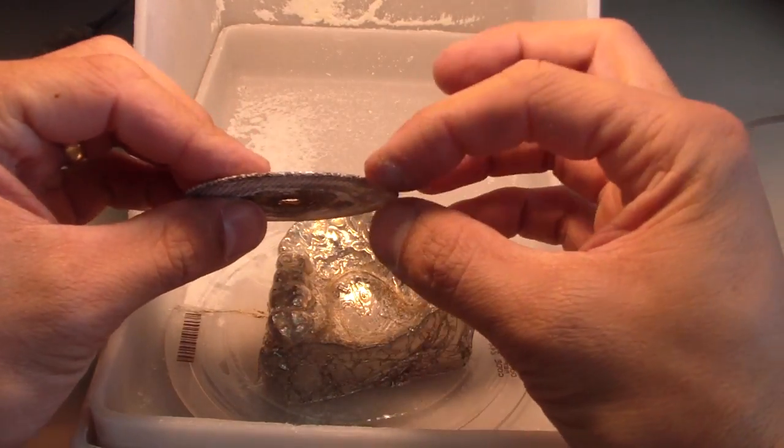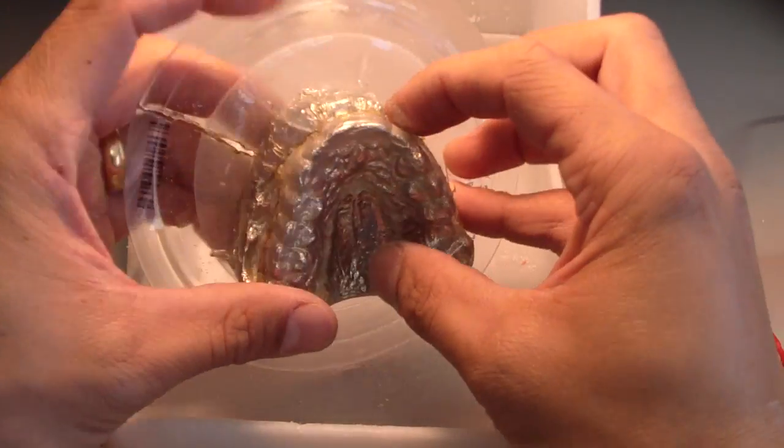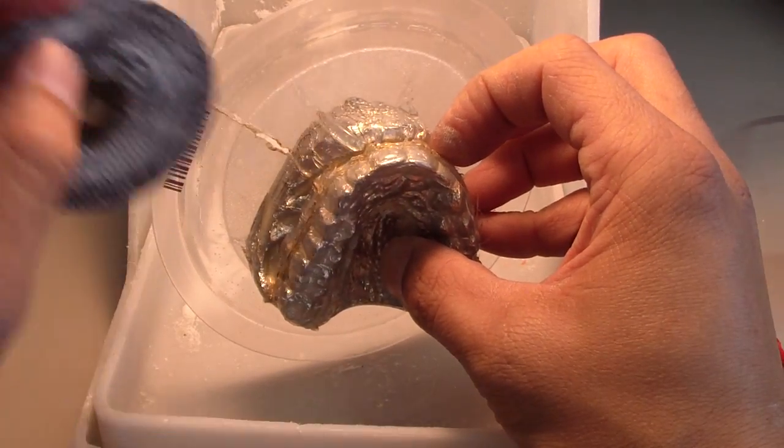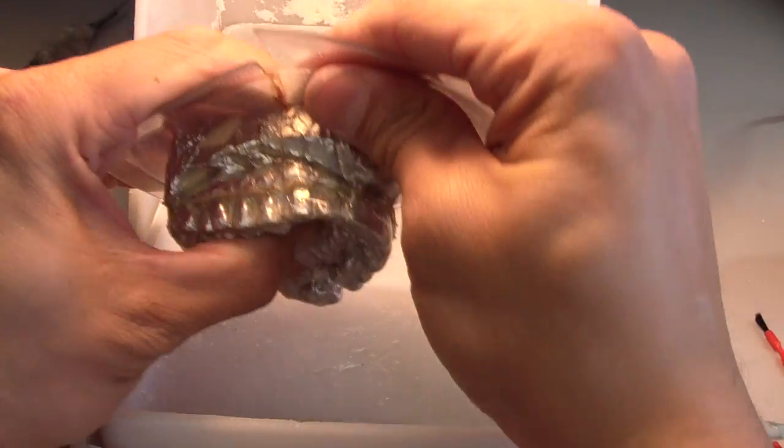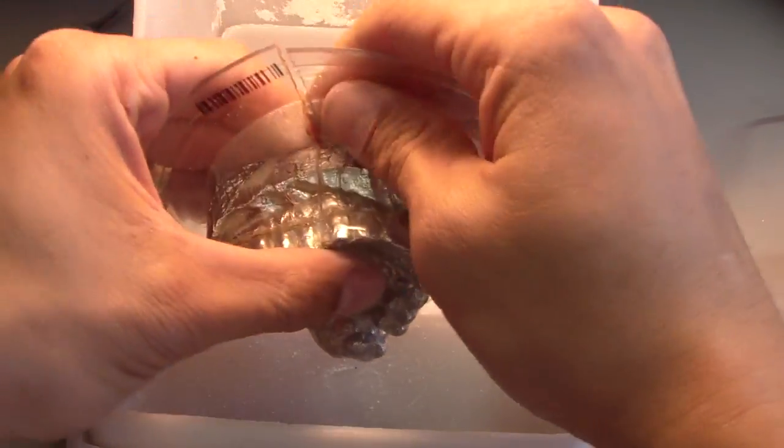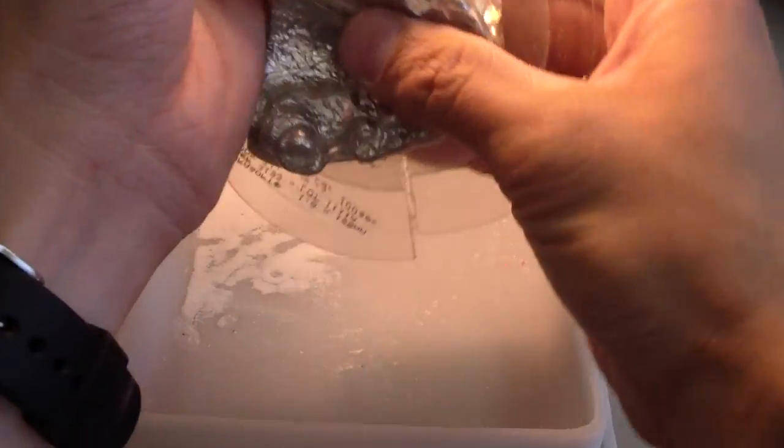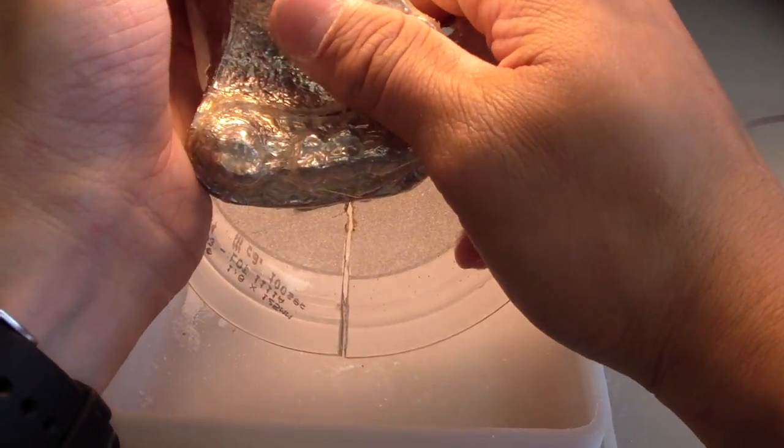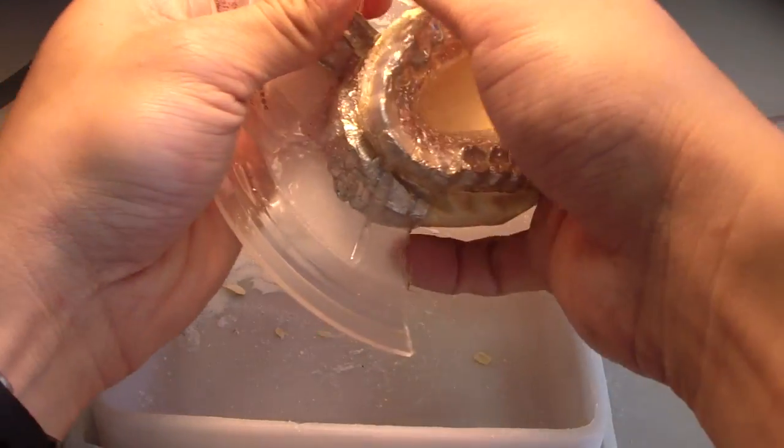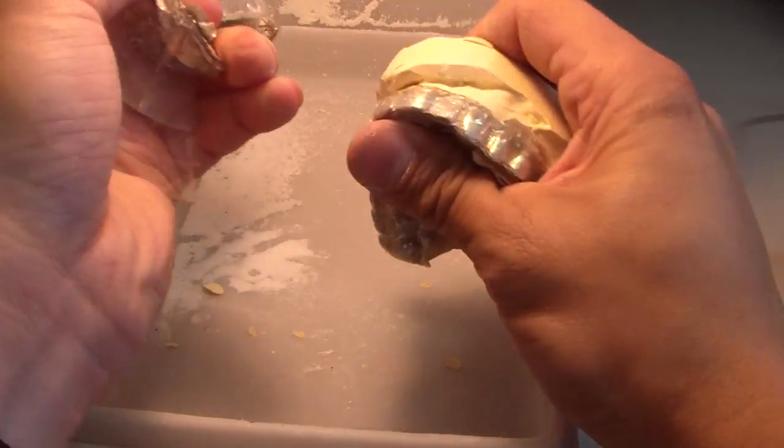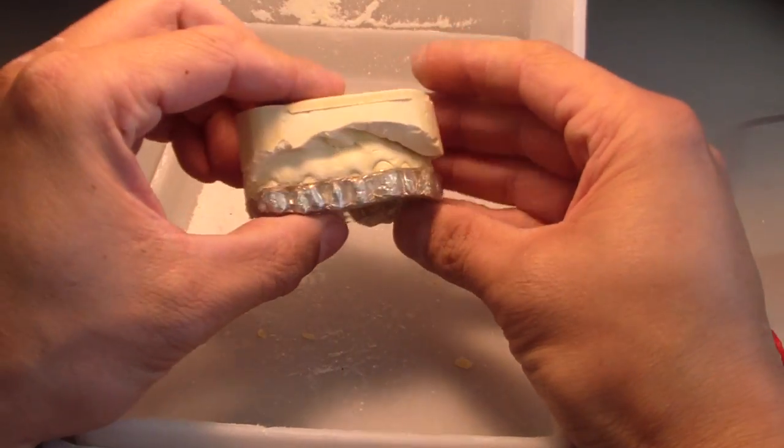The problem with using the electric knife is if you want to preserve the cast, this will section right through it pretty quick if you're not careful. You're still going to cause some destruction to the cast with the electric knife, but less than other methods. That's what we're left with.